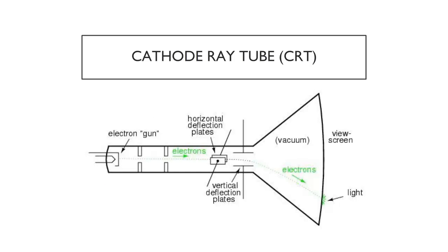Cathode ray tubes, or CRTs, are not used anymore, but they have a significant place in the history of medical imaging. These bulky monitors had plenty of disadvantages, but also have some advantages that can't be matched. For example, a CRT can be viewed at a wider angle. Because of the curved viewing surface, when standing off-centered from the display, one could still see the image. This means that multiple people could view the same image on the same screen simultaneously.